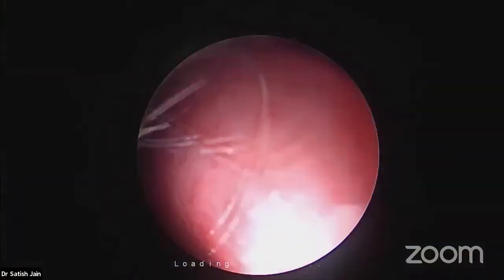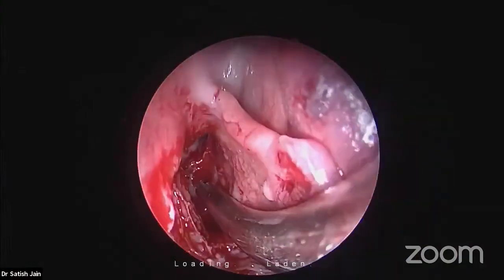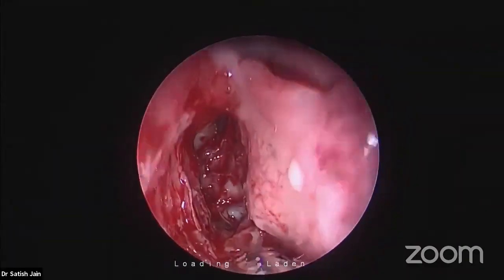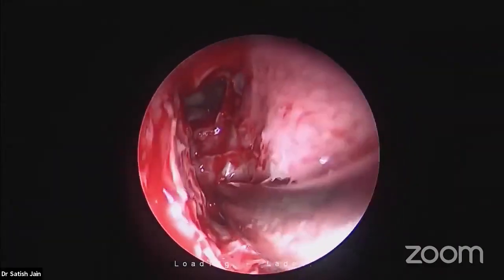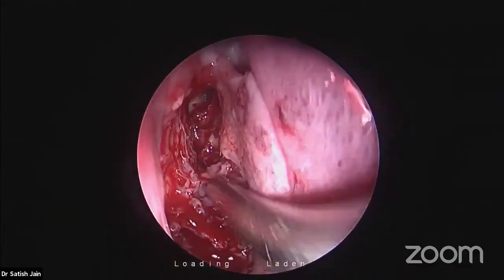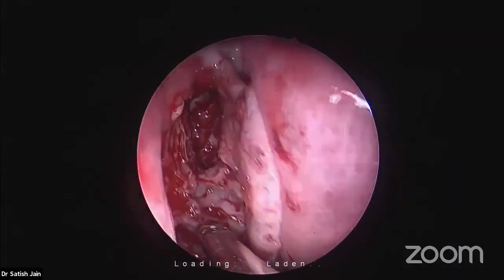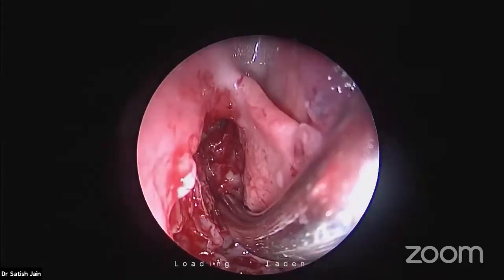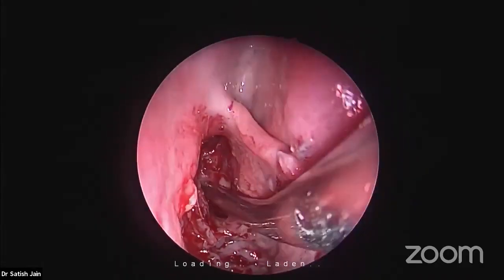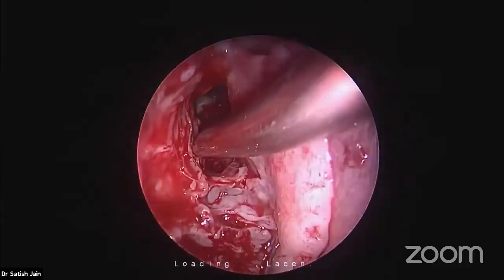See now, what we have done, we have removed the bulla. And now what we have achieved, we have exposed the anterior ethmoidal artery running along the skull base. See that? Now, in the situation Dr. Kranti was mentioning, with a suprabullar recess, the bulla would not have been going to the skull base. In that situation, you would find the anterior ethmoidal artery like this, exposed. So if you work along this region, you are more likely to damage the artery, if not aware of the fact. Be careful.